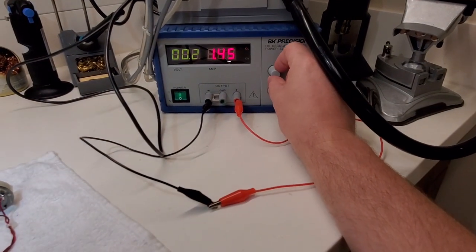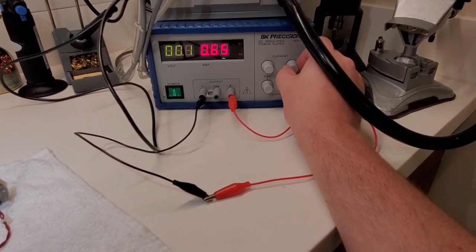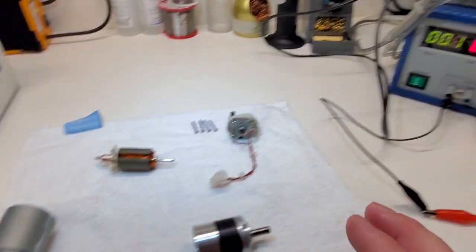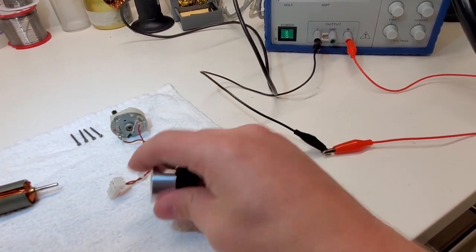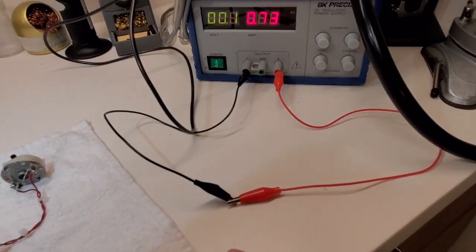Now, if this motor was good, I should be able to run it with less than an amp worth of current because there's no load. I don't have a tubing set on there, so the motor is just free spinning. The only drag is going to be this planetary gear reduction. But we'll go into that in a moment when we go into the teardown.